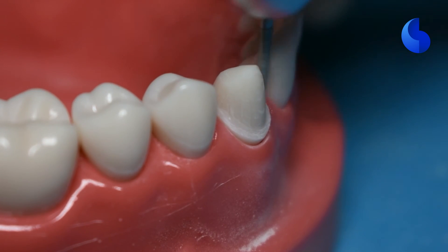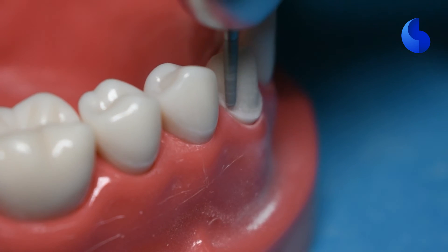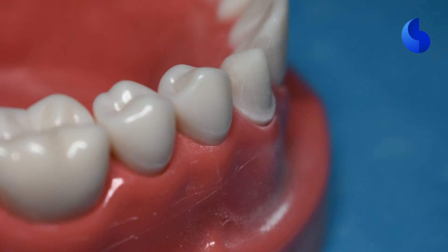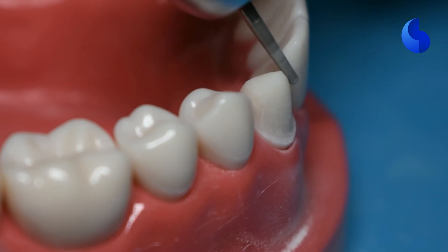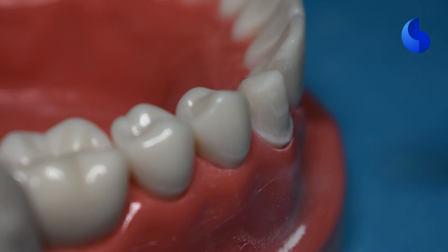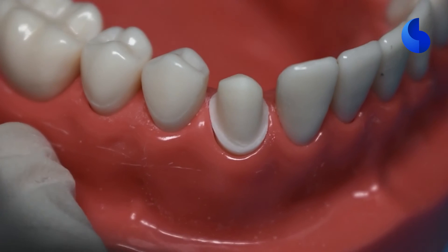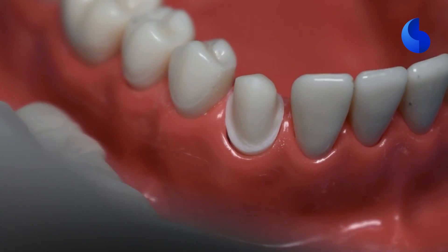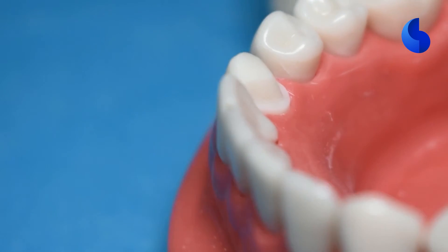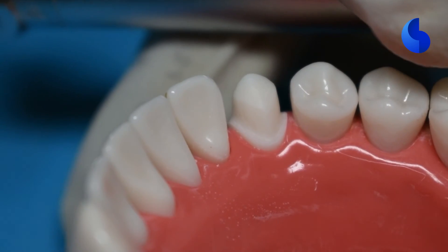And here is our finished product. Take a look at how it has an ideal taper — it's not leaning to one side, it's straight and parallel. The margins are supragingival by about 0.5 millimeters. And we've continued to maintain the lingual ridge that we were looking for.